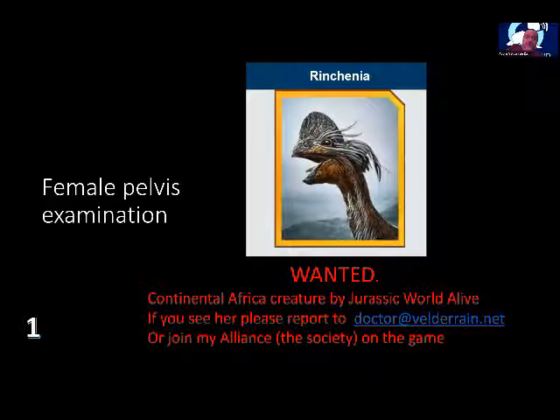We can perform female pelvis examination with several kinds of devices. We could use convex transabdominal approaches. We can use the linear transducers of not so high frequency. And we could use the endocavitary probes, named the transvaginal approach.